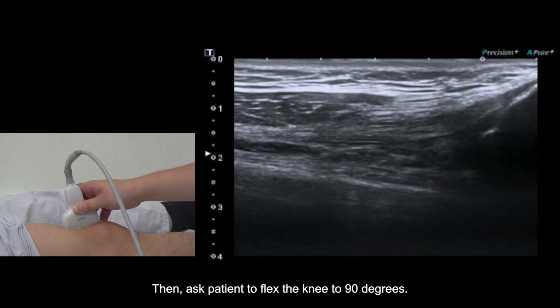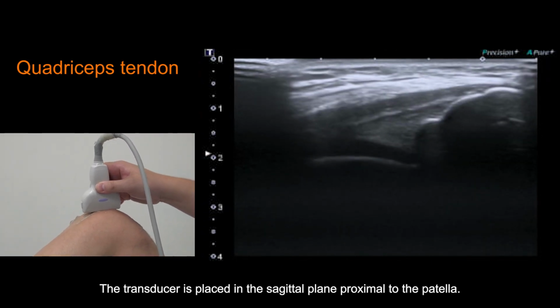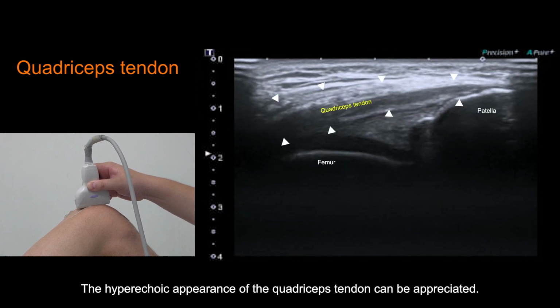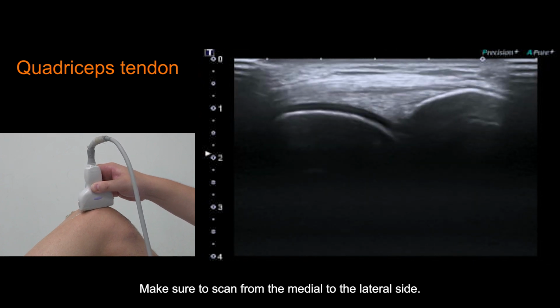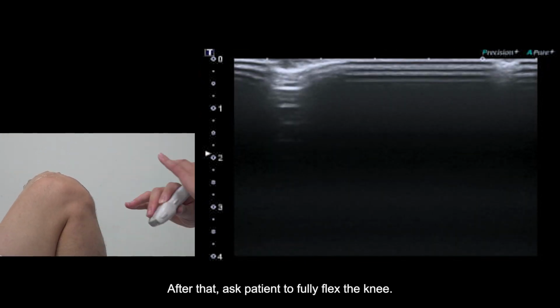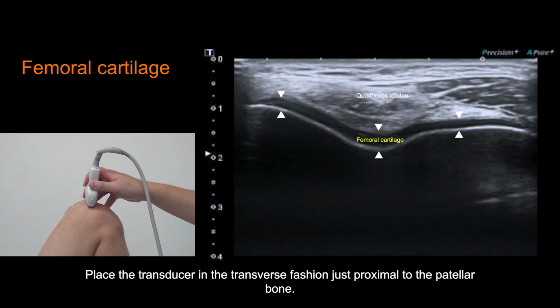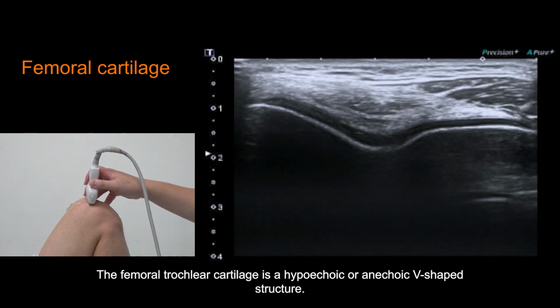Then, ask the patient to flex the knee to 90 degrees. The transducer is placed in the sagittal plane proximal to the patella. The hyperechoic appearance of the quadriceps tendon can be appreciated. Make sure to scan from the medial to the lateral side. After that, ask the patient to fully flex the knee. Place the transducer in a transverse fashion just proximal to the patellar bone. The femoral trochlear cartilage is a hypoechoic or anechoic V-shaped structure.